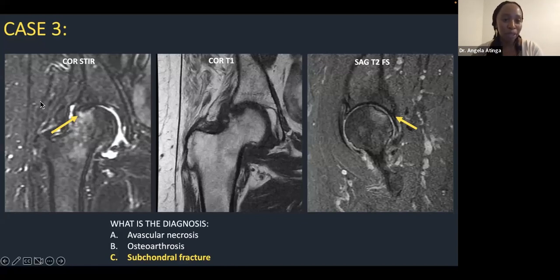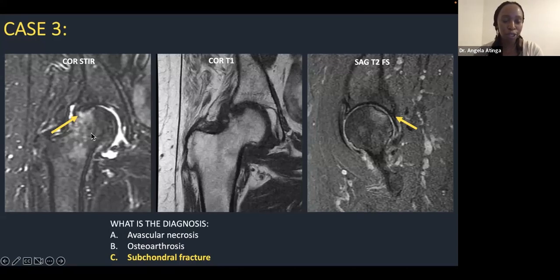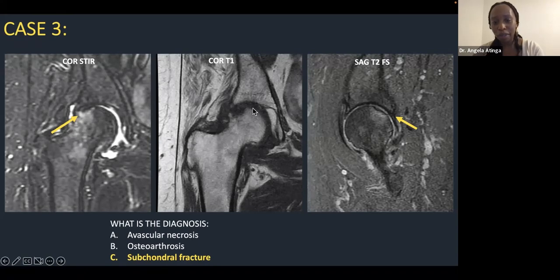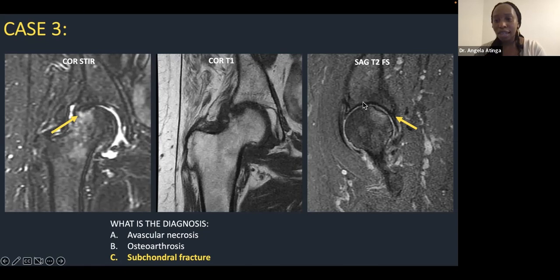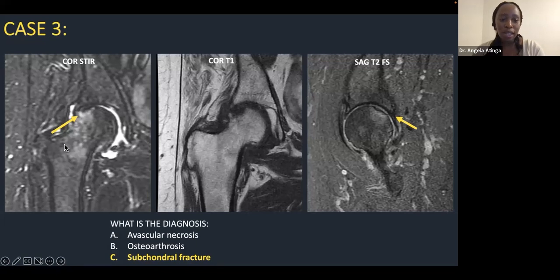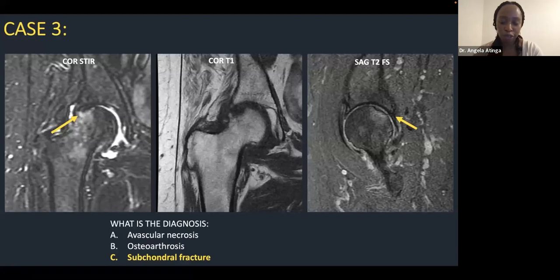Case 3: on the coronal STIR images — an older sequence with poor spatial resolution — there's subtle condensation of the subchondral bone with edema tracking down towards the intertrochanteric region. On T1 images the subchondral bone is not well seen. The sagittal T2 fat-sat images show flattening of the femoral head contour and subchondral bone marrow edema. A key teaching point: if you see edema tracking toward the intertrochanteric region, look very carefully through all sequences for a subtle subchondral fracture.